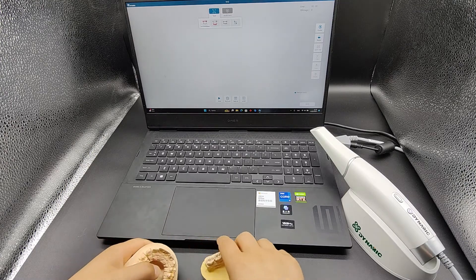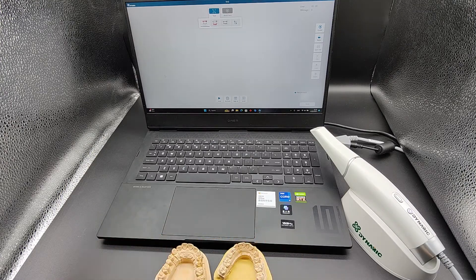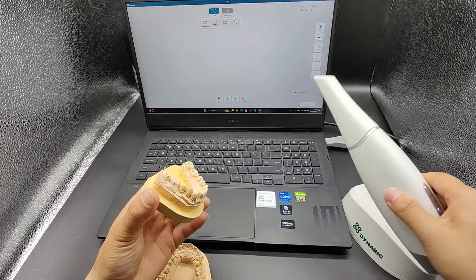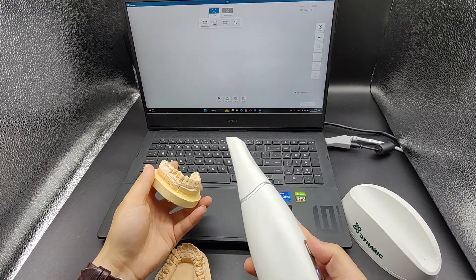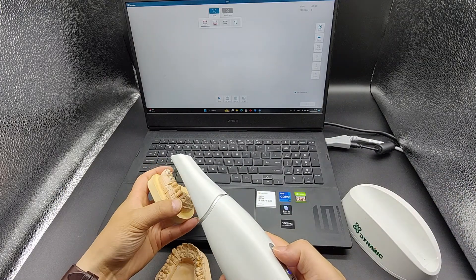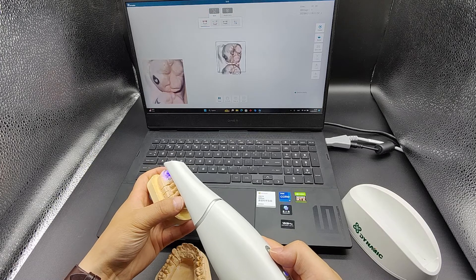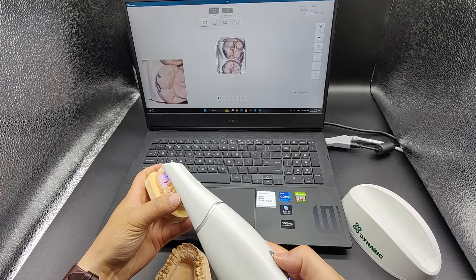Clean the patient's saliva or blood in the mouth before scanning. Start scanning from the occlusion surface of the posterior teeth first. Keep the tip parallel to the teeth, with a distance of 1-2 mm between the tip and the teeth.